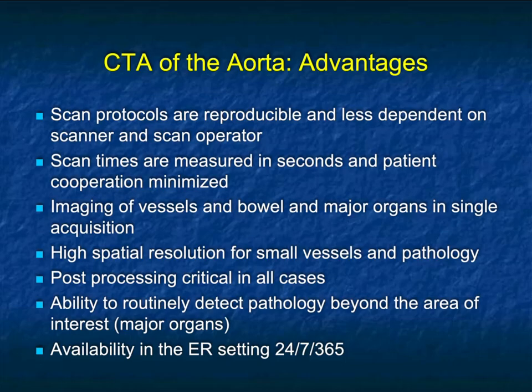Patient cooperation is minimal as the scan times are measured in seconds. The ability to look at vessels and bowel and soft tissue and different organs on a single acquisition. And again, we spend a lot of time thinking perhaps about organs like the liver, the spleen, the kidney, but not really thinking all that much about the vessels. So we need to really make sure we do think about the vessels.